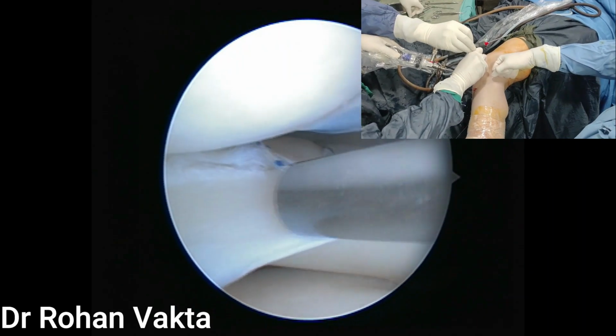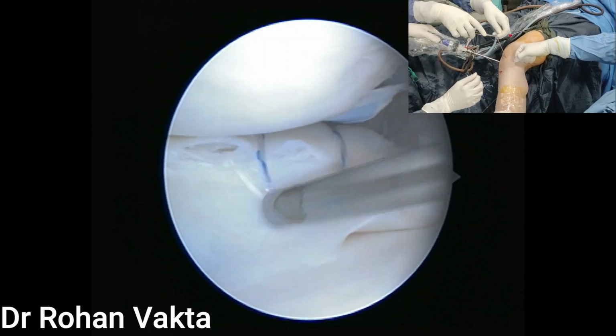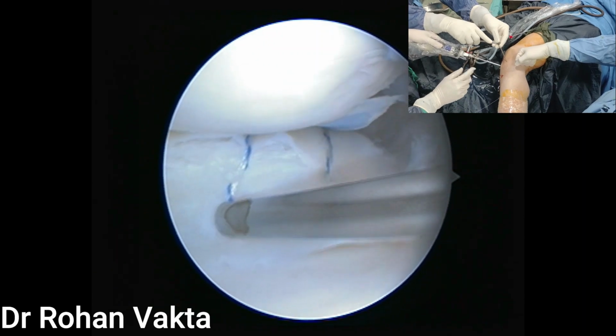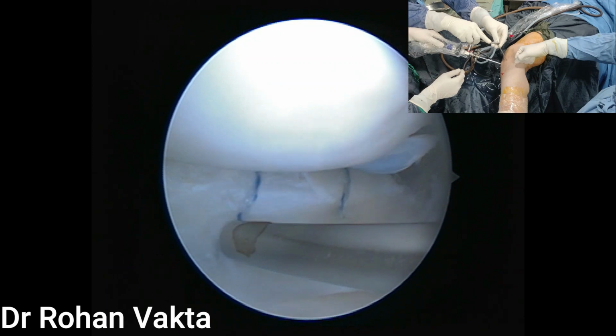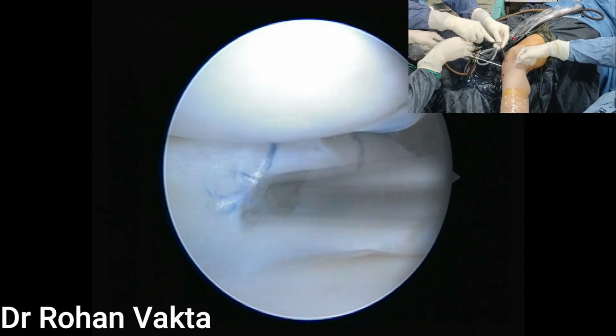A little bit more medially the stitch is taken, which will also cover the partial longitudinal tear. The same step is repeated till the entire ramp area is covered. In this case, 3 stitches were taken.